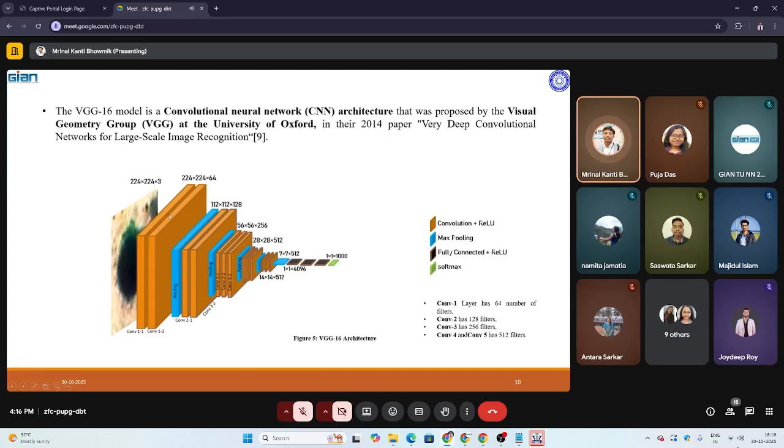While passing the image as input to the convolutional neural network architecture, these blocks represent convolution, and then we perform max pooling. I have already mentioned which block represents what, and I have explained the operations elaborately on the further slides. First there are 2 blocks of convolution and then max pooling happens. What is the work of max pooling and how does convolution happen? I have explained the mathematics in the further slides.